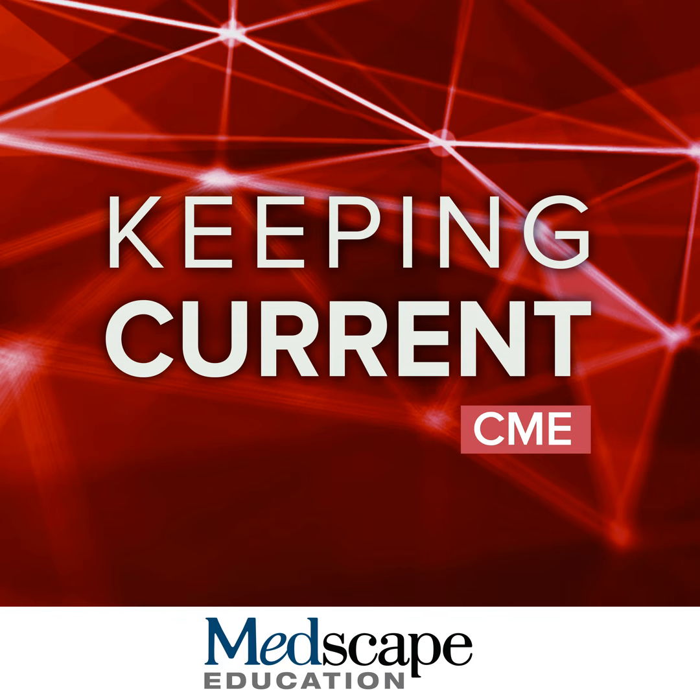If a patient is asymptomatic but has elevated risk, at this time in the United States, amyloid PET is not covered by insurance and not considered appropriate because those patients are not currently approved for these therapies. This may change in the future. There are a lot of clinical trials in progress, but right now, this testing is reserved for patients who are symptomatic and who are suspicious to have Alzheimer's disease, again, because this can give them access to treatment.